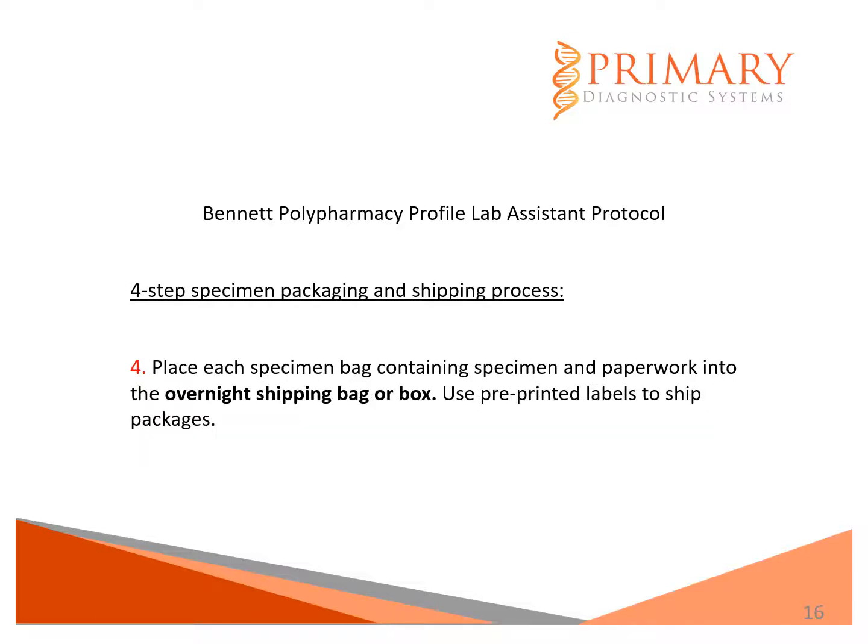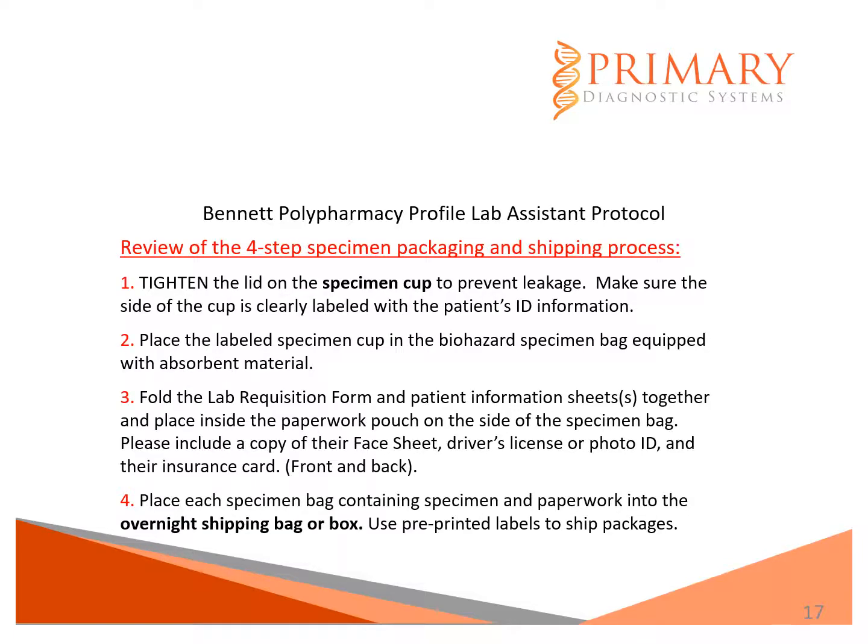And the fourth step in the specimen packaging and shipping process is to place each specimen bag containing the specimen and the paperwork into the overnight shipping bag or box. Use pre-printed labels to ship these packages. Please take a moment to review the four-step specimen packaging and shipping process.